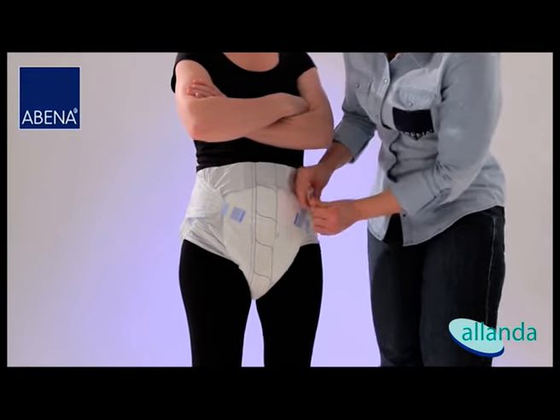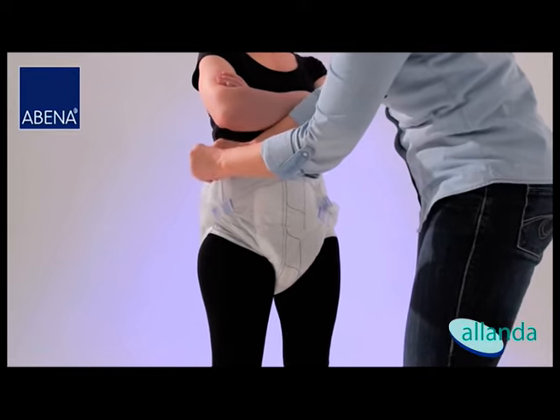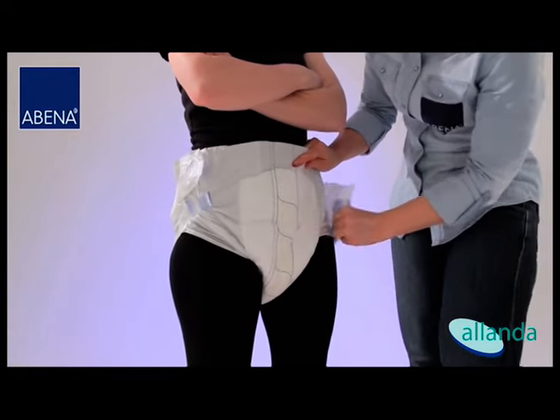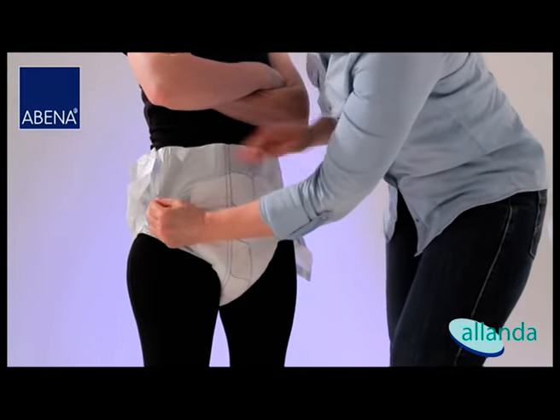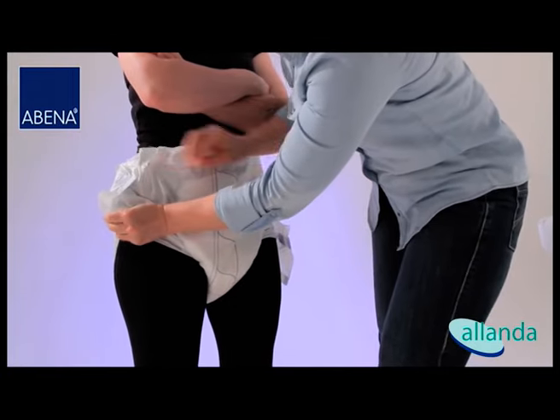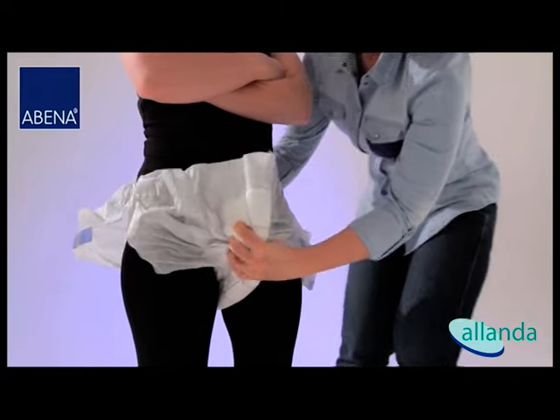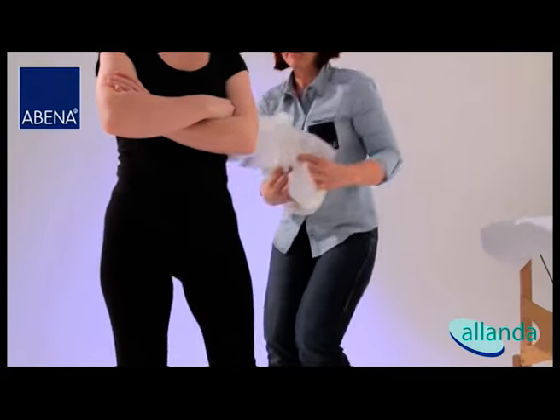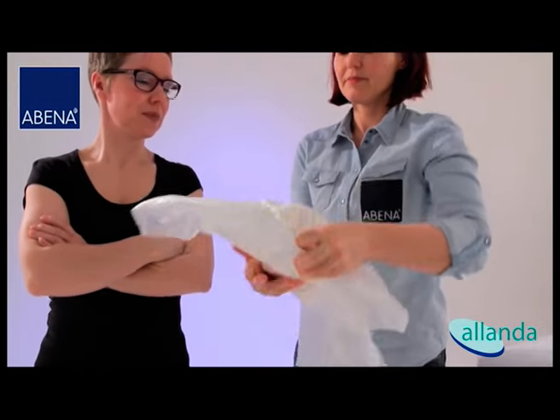Check the edges to the front. During the removal of the Abri-Form, please ensure that the tapes are adhered to the product after opening it to avoid any skin damage. Remove the product from the front to the back and roll it up. Please secure the product with its own tape and discard it.